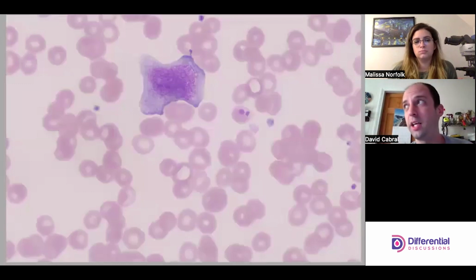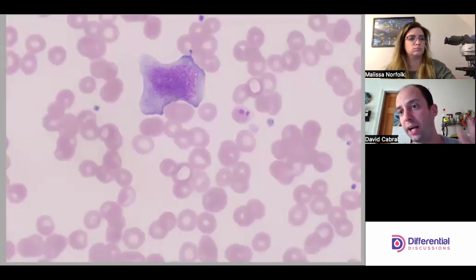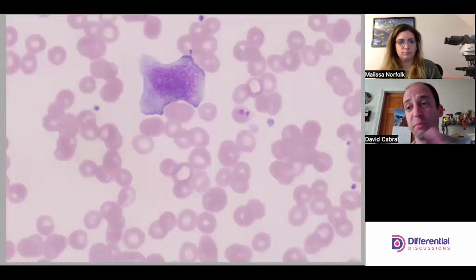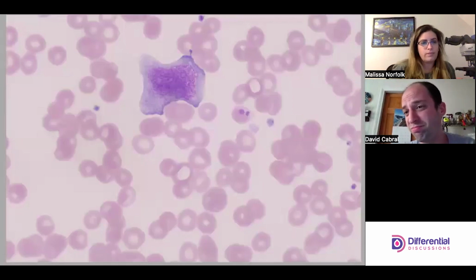I think typically when we talk about the maturation, especially of something like a neutrophil, there's a lot of categorization on the in-betweens, on the extremes, right? We start with blast to pro-myelo, etc. For the monocytic lineage, it's a mono, it's a blast, or it's in between. And we call those in-betweens our pros. So with a pro-mono, we're looking for nucleoli, right? What do you think, Melissa?